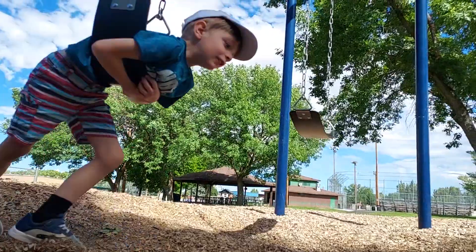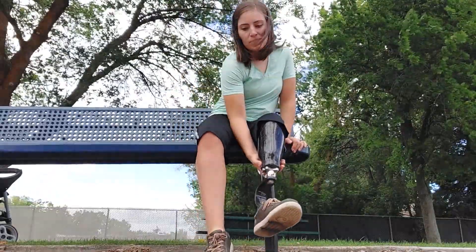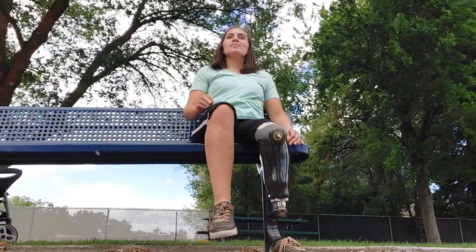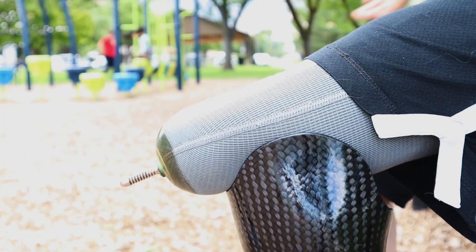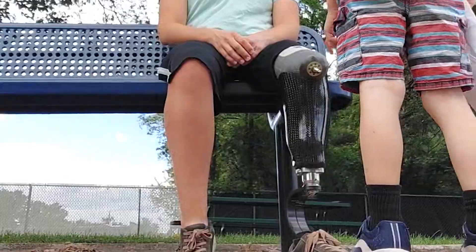Nowadays, we've got two main approaches: pins or suction. If you're in the mood to freak out small children, simply unclick your pinlock liner from its socket and sit around in public with this big old pin sticking out the end of your leg. Kids always assume that giant pin has been implanted inside you.